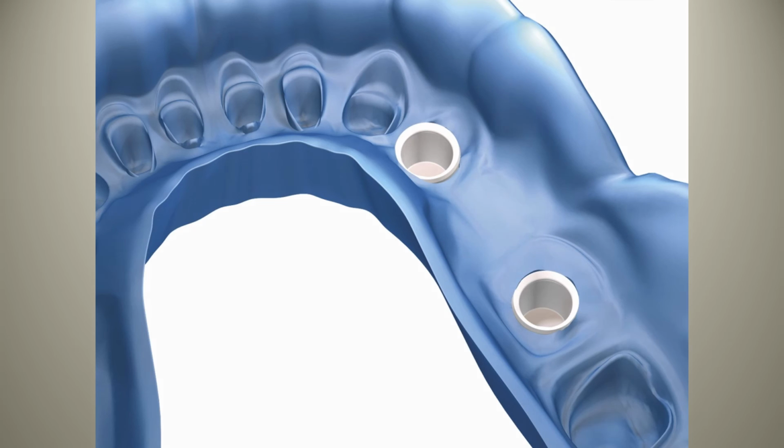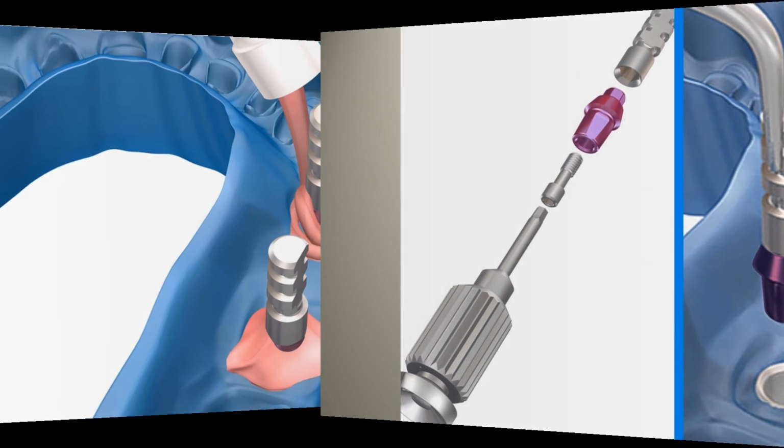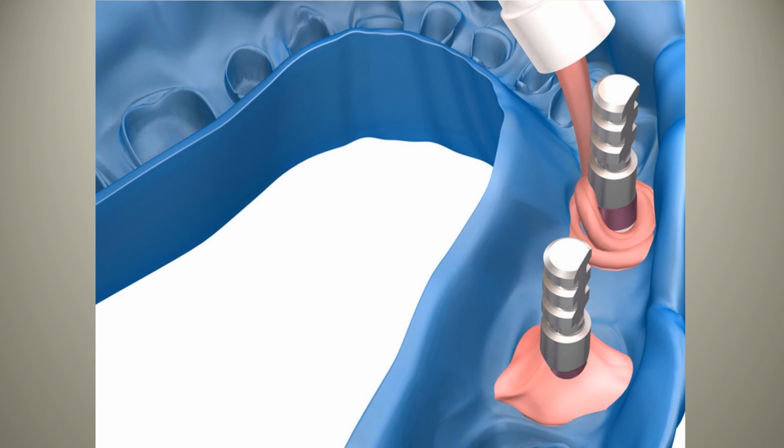And then it's just a matter of unscrewing those impression copings that were inside the implants. And in this picture, you can see that they've actually taken the little impression copings out of the implants, out of the patient, and now they put them into the fixture analogs. And basically, it's a matter of snapping those back into position and taking a bit of a soft tissue mask and pouring that initially around this model, and then finally completing the pour up with stone.